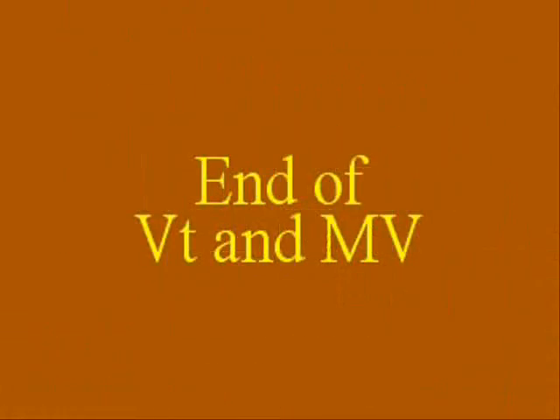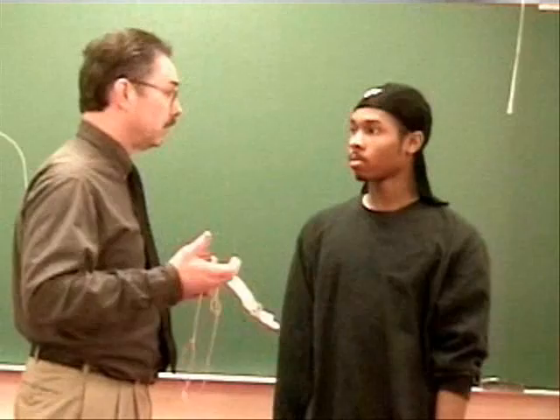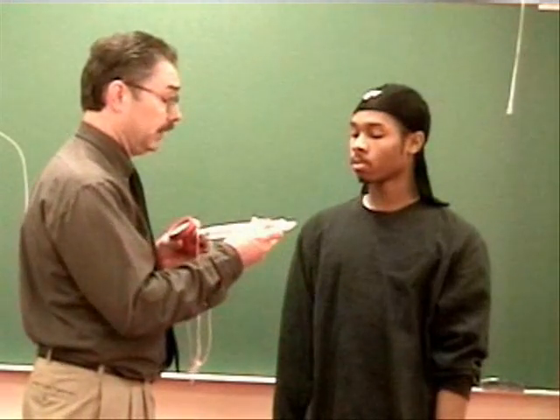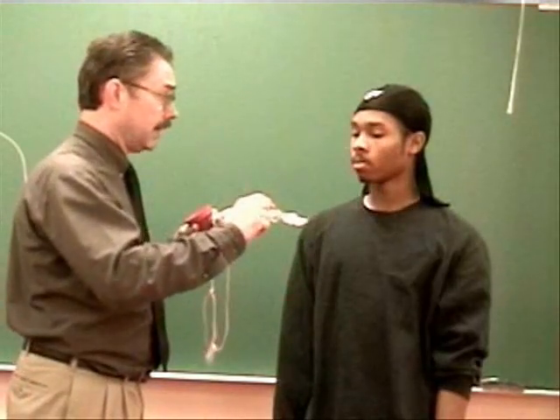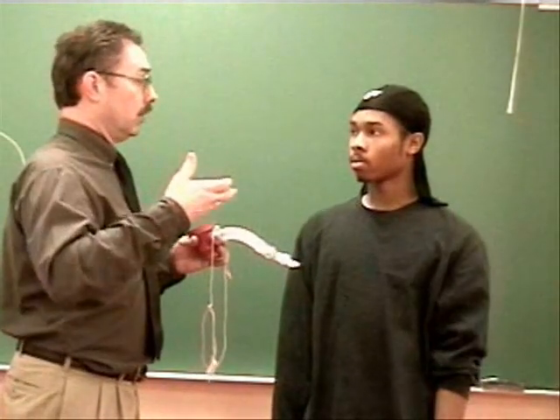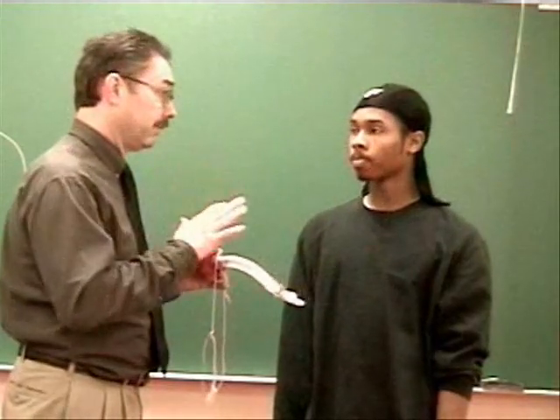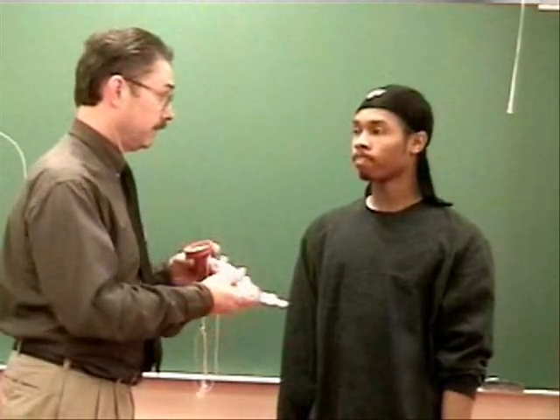Now the next measurement we can do is called a vital capacity. Now, Mr. Jones, what I want to do is measure your maximum breath size. So what I want you to do will be to take a breath in through here, great big deep breath, and you breathe from this side. And then when your lungs are full, I want you to blow it out and it'll blow onto the spirometer. Not fast, just a medium speed exhalation, okay?